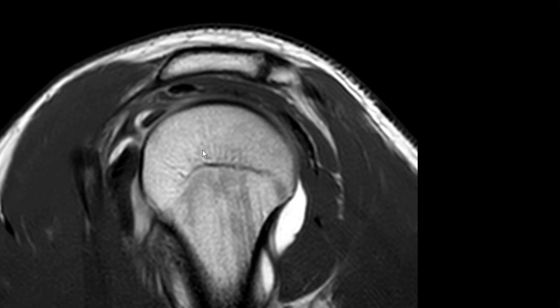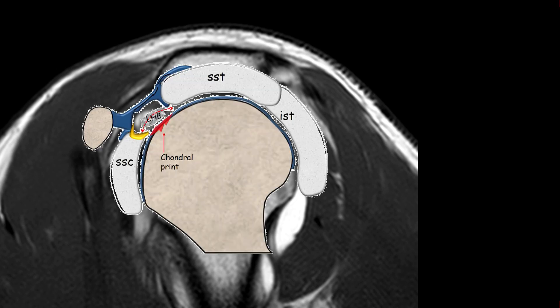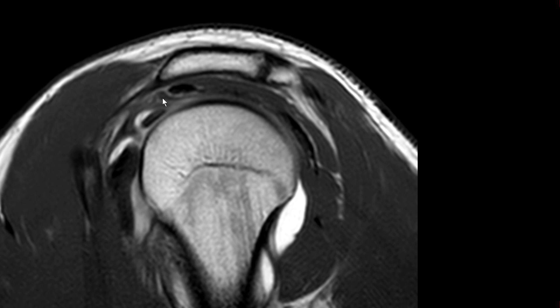Here is an MR image at approximately the same location, and you can nicely see the subscapularis tendon, the supraspinatus tendon, and the long head of the biceps tendon. All this stuff here is probably the coracohumeral ligament, and this structure here is the superior glenohumeral ligament forming the sling — basically the pulley keeping the tendon in place. This might be an oversimplification since we don't really go into detail about what is ligament versus joint capsule and all these sub-parts, but in the real world you don't really want to do that anyway.